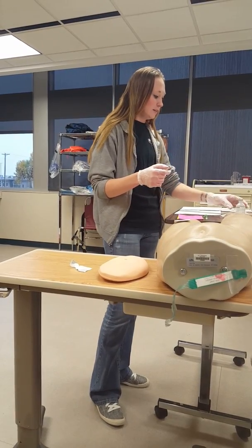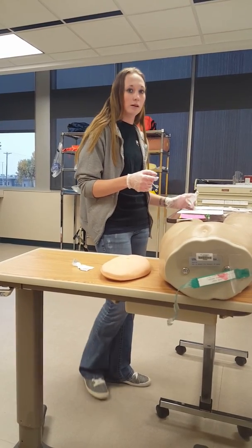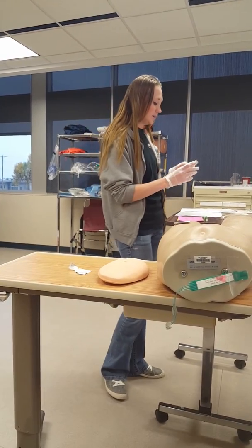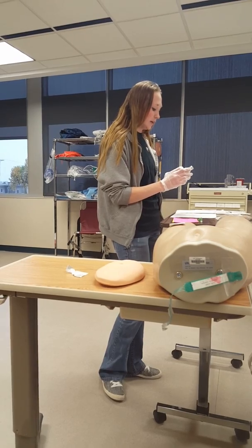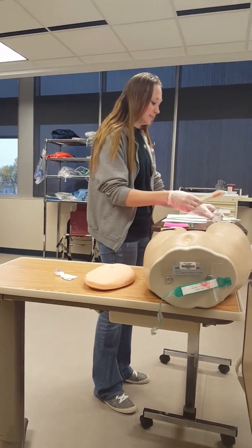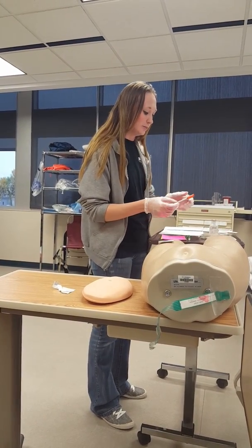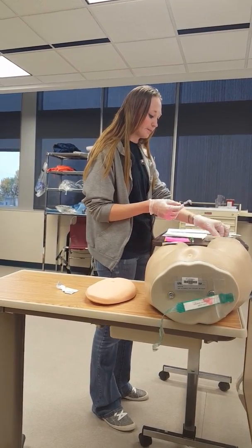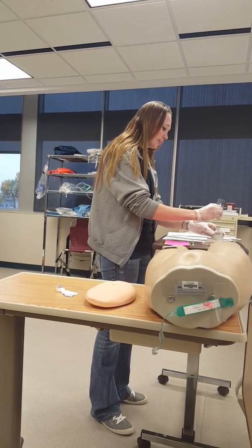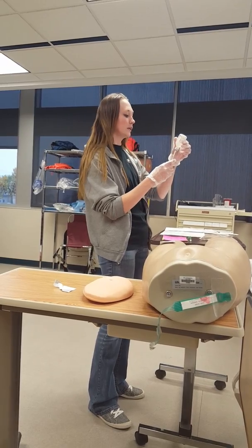All right, and then I would check my vial to my MAR again, and it says the Novolog, and I'd be giving you 10 units. That's what the MAR said, and then I'll put my needle in.